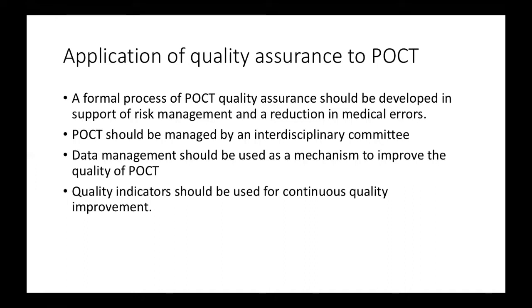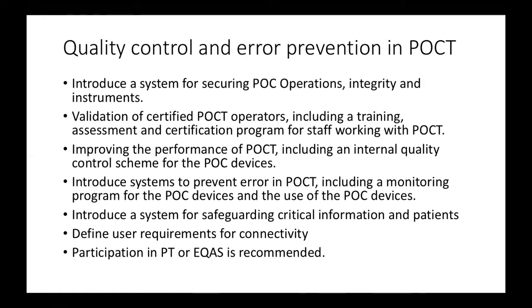And data management is very important. Maintain data so that it can be used as a mechanism to improve the quality of point of care testing, and as we develop quality indicators as per ISO 15189 clause 4.14.7, develop some quality indicators for point of care testing also, and monitor those quality indicators and see whether you are able to provide good point of care testing or not.